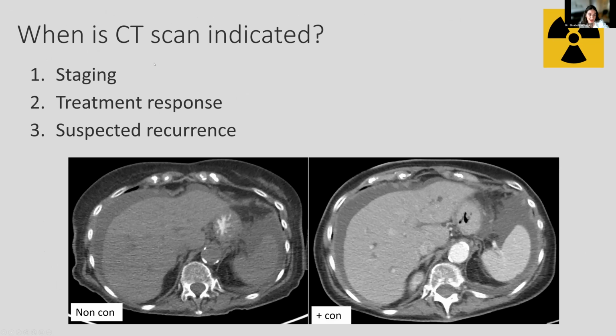So I'm just going to talk a little bit about CT. So when is a CT indicated? As we mentioned previously, staging, and it is also integral for treatment response, and also in the case of a suspected recurrence.